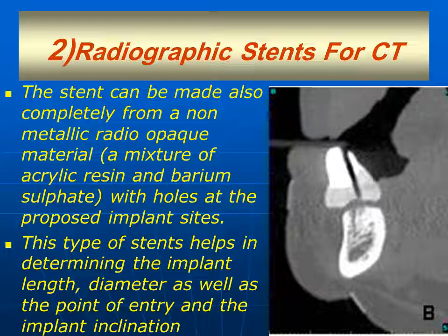It can be seen to select the proper position for implant placement, guided by the holes made in these stents. This type of stents helps in determining the implant length, diameter, as well as the point of entry, and in addition it can show the implant inclination.